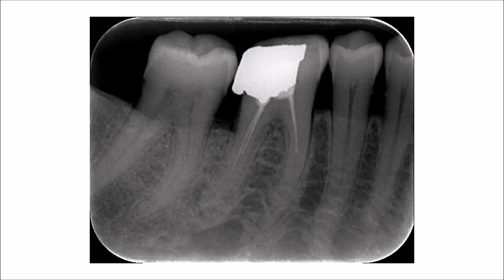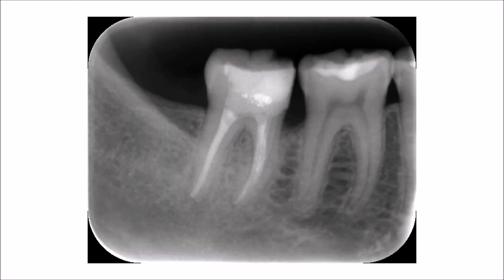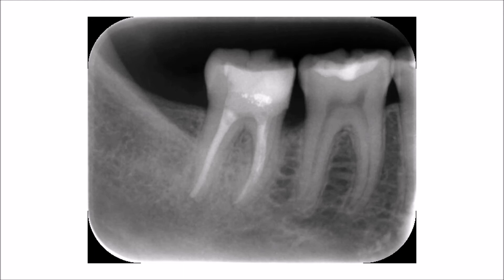Looking at this other radiograph, you will see that in this area the bone does not maintain its parallel relationship with the cemento-enamel junction, but instead goes in an angular direction. As you can see, the open contact present between these teeth may have initiated and promoted this angular bone resorption.